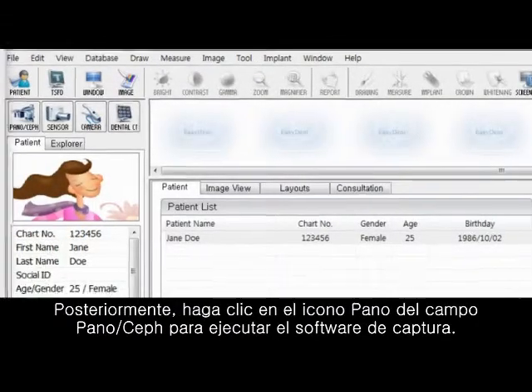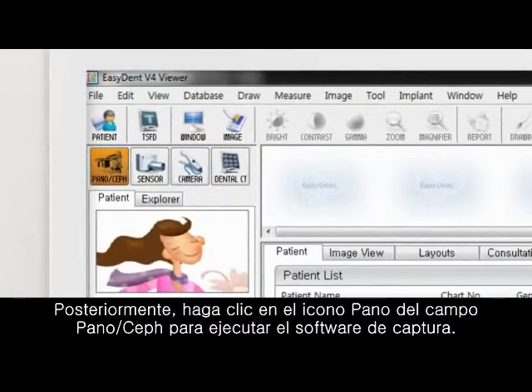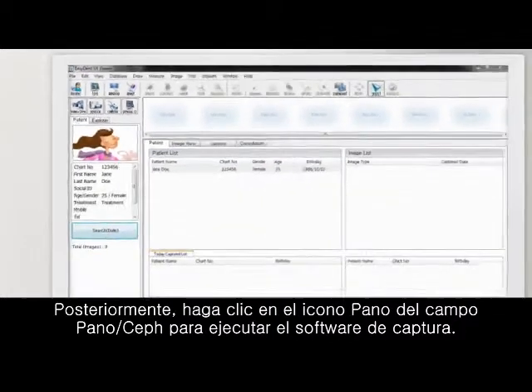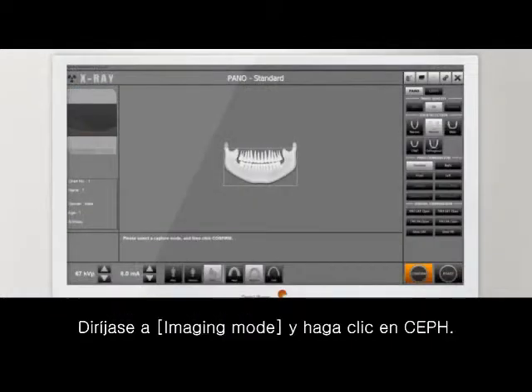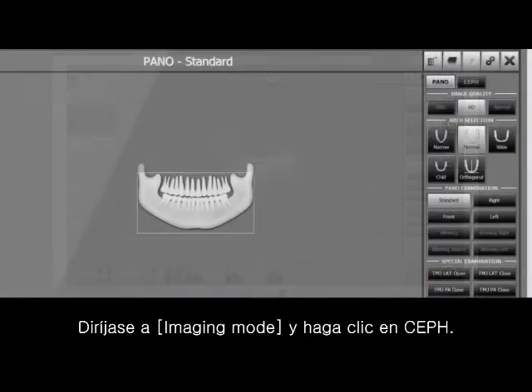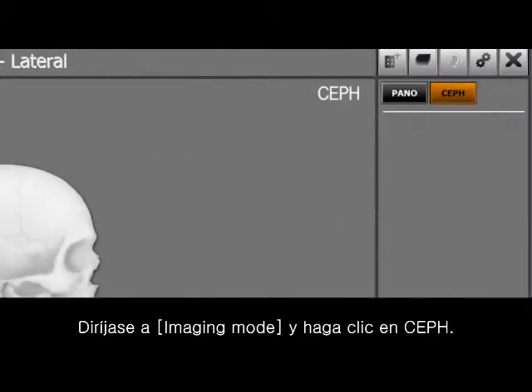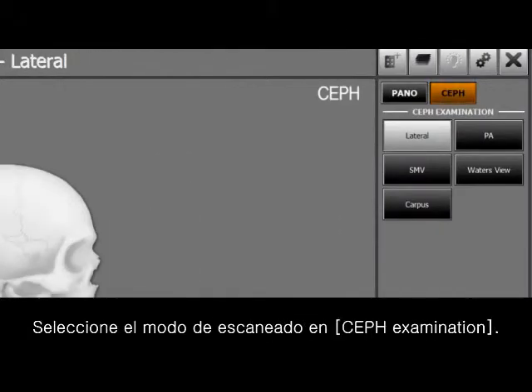Then click the PANO icon on the PANO CEPH field to run the capture software. Go to imaging mode and click the CEPH. Select the scanning mode on the CEPH examination.